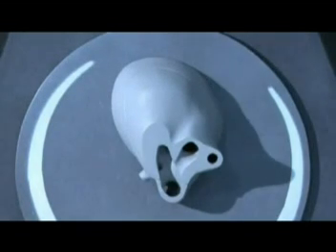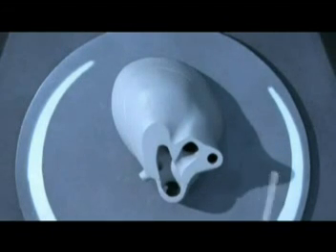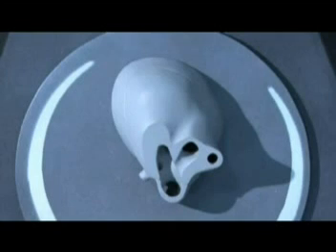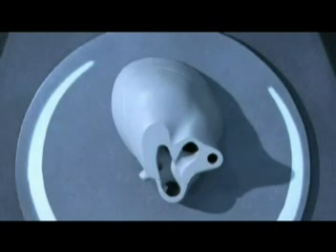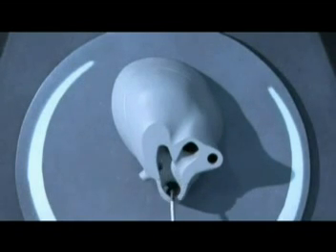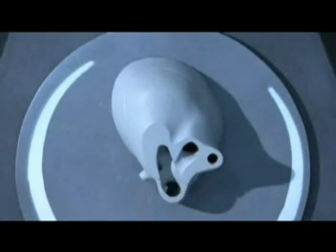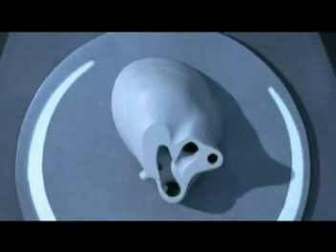In the view shown, the baby's lying on its back with the left side on the left and the right side on the right, so the head is out towards us and the feet are into the screen. In this view it would be quite tricky to see the arches using 2D imaging because they're both running away from us, but you can see the ductal arch here, the aortic arch which has come over the top of the right branch with the right branch appearing out here, and the superior vena cava. The pulmonary outflow running into the ductal arch and the aortic arch are both visible.